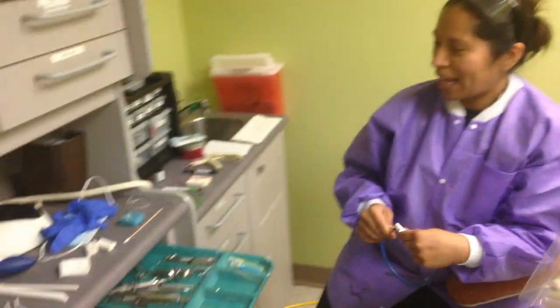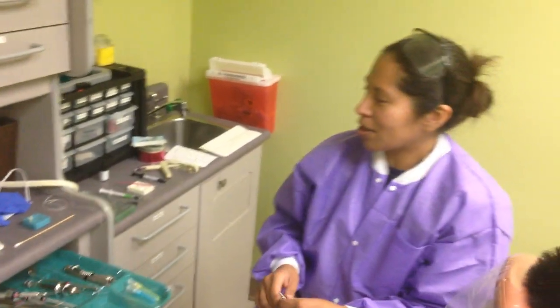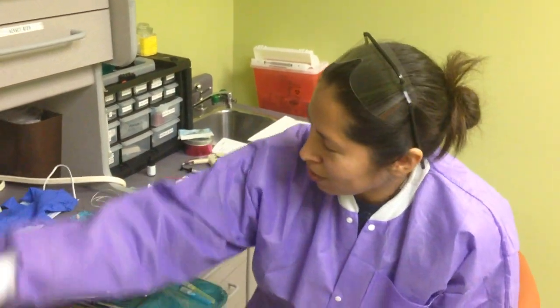We're setting up for fillings, restorative composites — all the same thing. When you start as an assistant, you're going to start with anesthesia first.